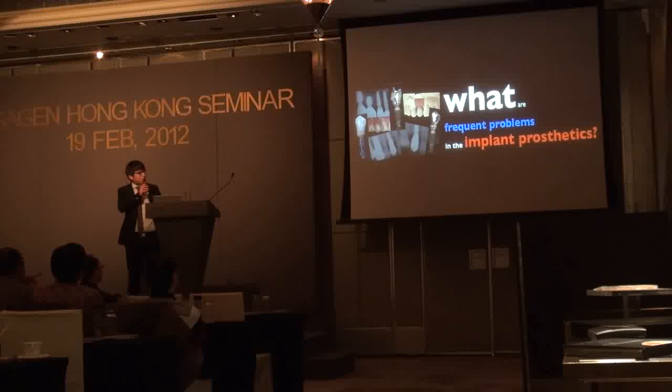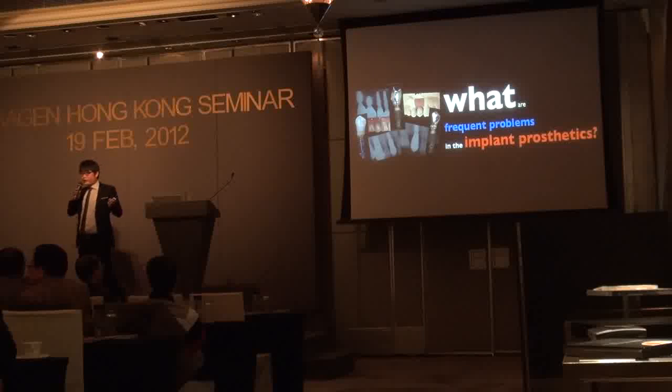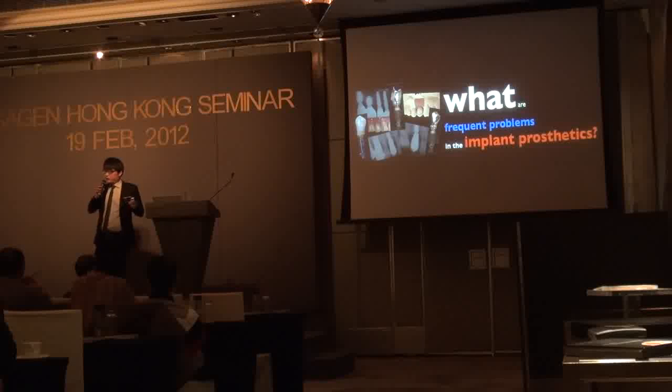What are the frequent problems in implant prosthetics? The most frequent problems make you headache. Patients will complain a lot, and as some doctors asked Dr. Park just before, even with screw loosening they will complain about implant loosening, and it is very difficult to persuade them it is safe or not.